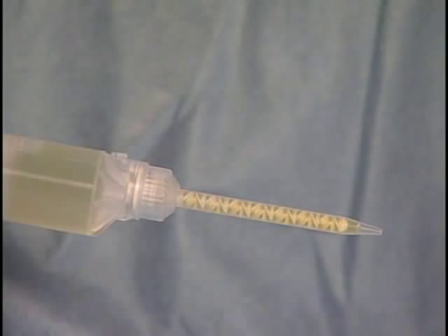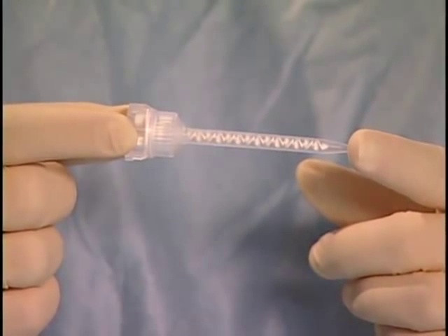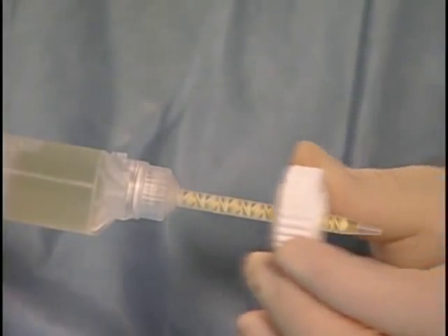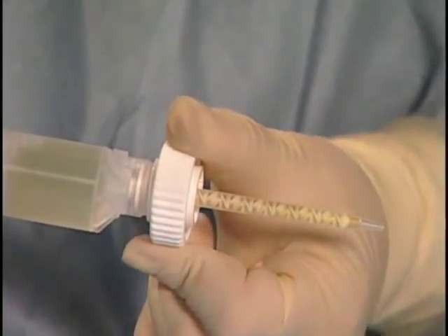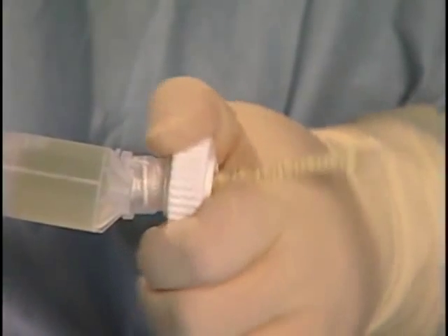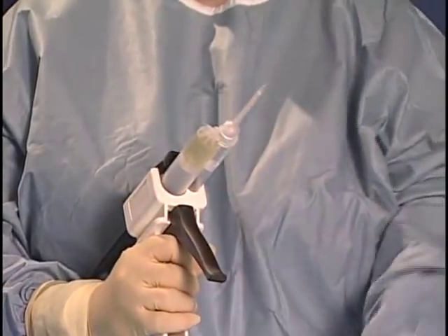During the course of the procedure, the applicator tips may become occluded with polymerized BioGlue. Therefore, it is very important to have replacement tips readily available. To remove occluded applicator tips, hold the applicator tip collar, rotate 90 degrees counter-clockwise, and gently lift the applicator tip off of the solutions cartridge. The twist ring tool may be used to assist in the removal of the applicator tip. To attach a new applicator tip, follow the procedure previously outlined in this video.